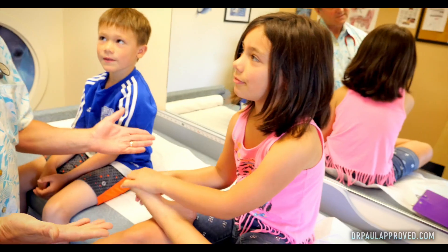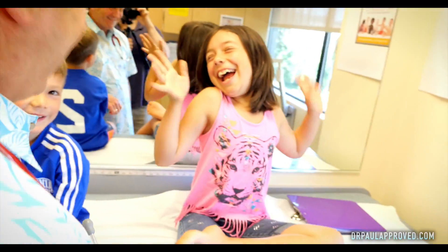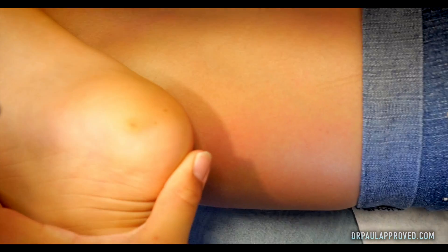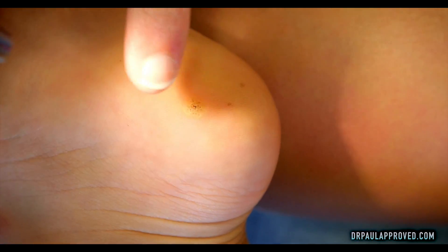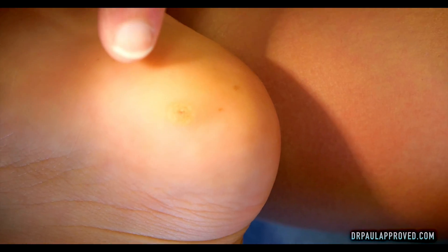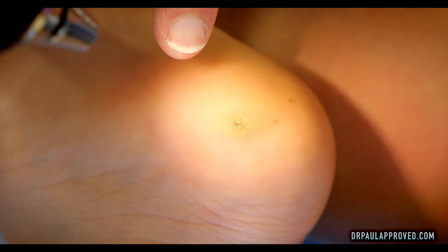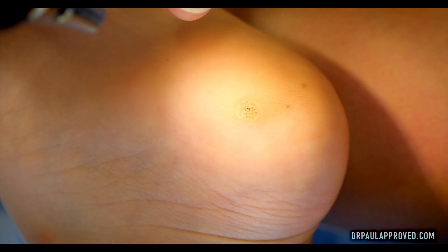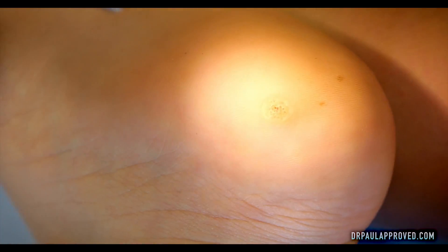Hello! For the star of the day — something is bugging. There you go. For our viewers, you can see little black dots in that raised... that raised something or other. So for those wondering what that could be, that, folks, is a wart. A plantar wart, which is fancy terminology for a wart on the sole of your foot.